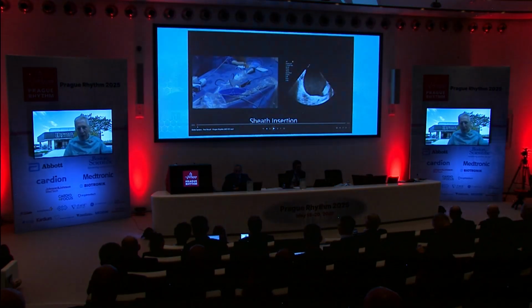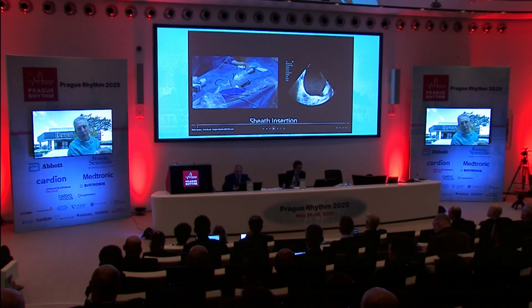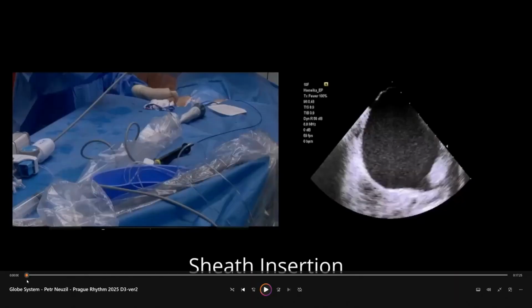Okay, so I will run. I have no introduction slides. It's a persistent atrial fibrillation patient. We did the case through the PULSE EU trial, and I will start playing now. Okay, so let me start the movie.